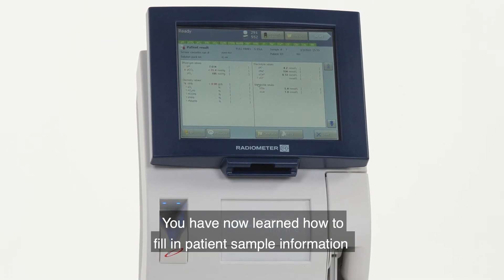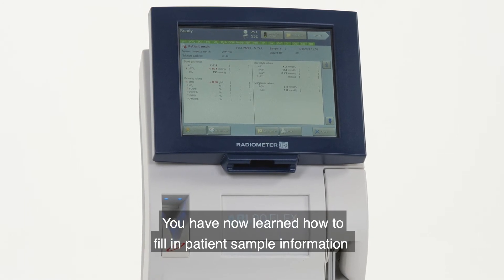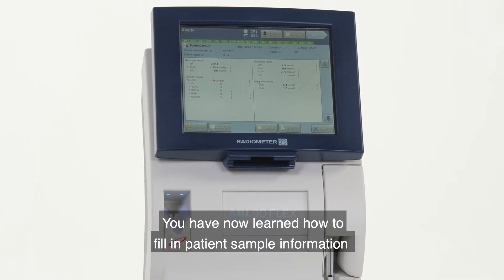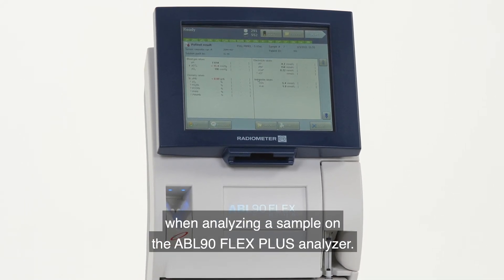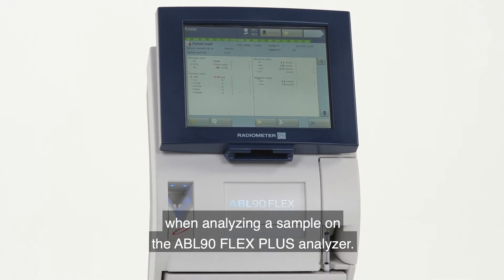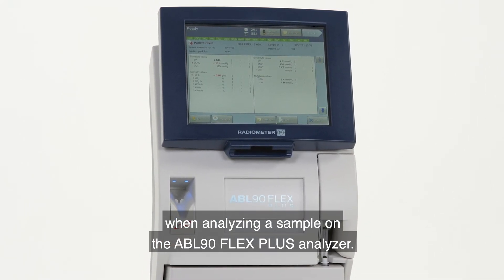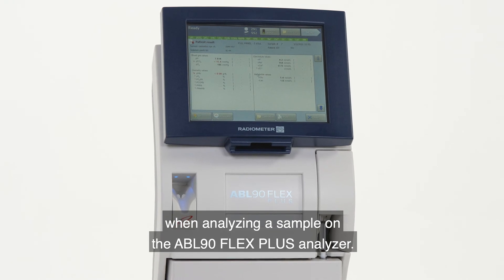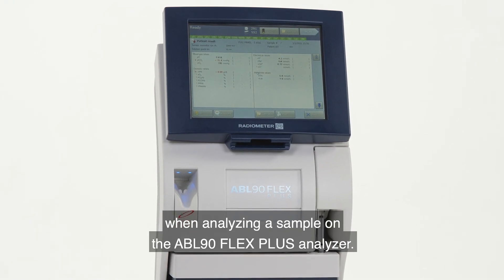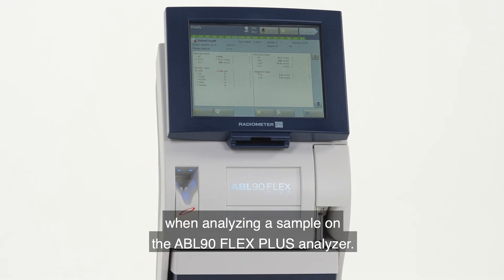You have now learned how to fill in patient sample information when analyzing a sample on the ABL90 Flex Plus analyzer.